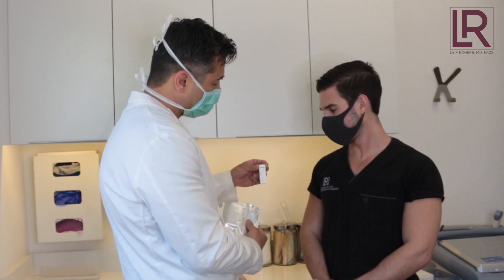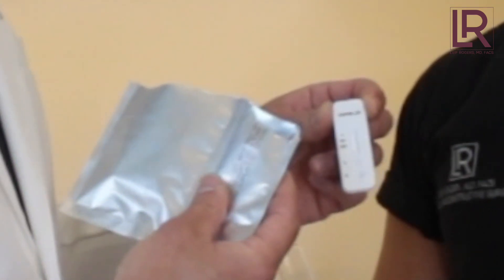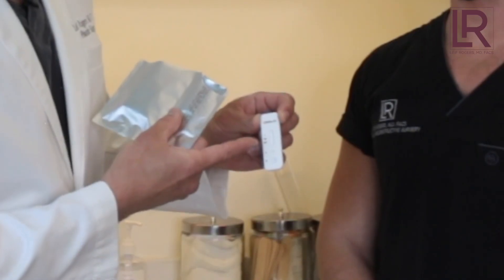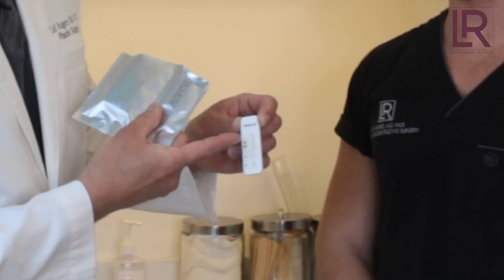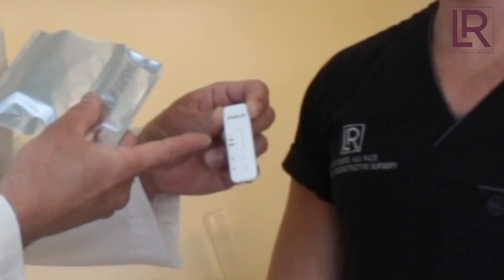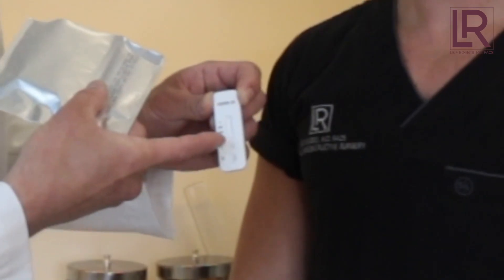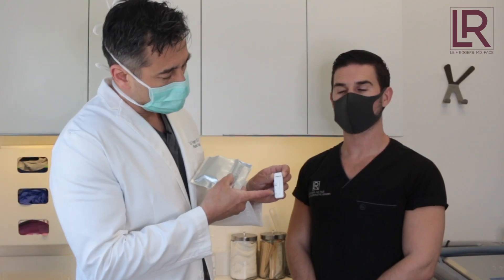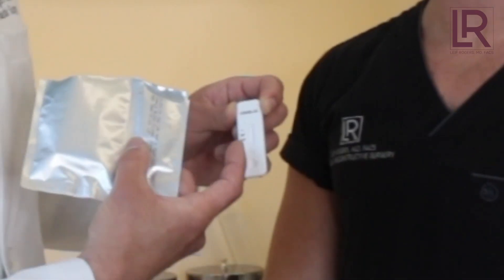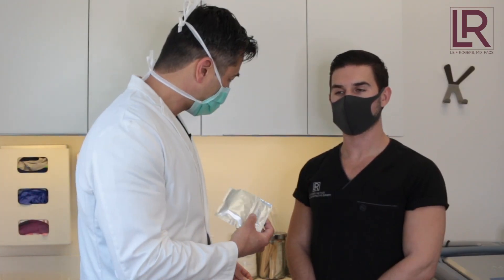Here's this COVID-19 test — you can see it's got a little plastic thing here. It looks almost very similar to a pregnancy test. There are going to be a couple little marks on it if you're positive. There's IgM, IgG, and C for control. You'll always see a faint line at control; if you get a positive, it tends to be a pretty bright line. You put blood in a little square spot — just a drop — then you put the buffer, which is a clear solution, and it drags the blood over the little test strip to show whether it's positive.